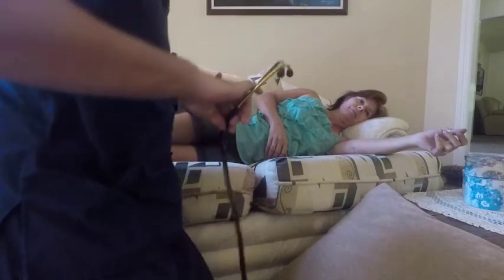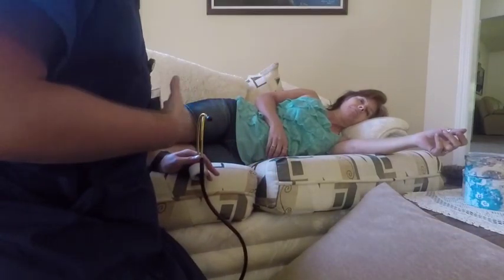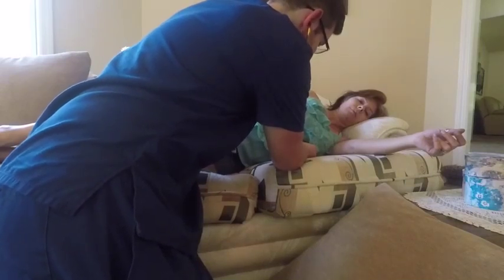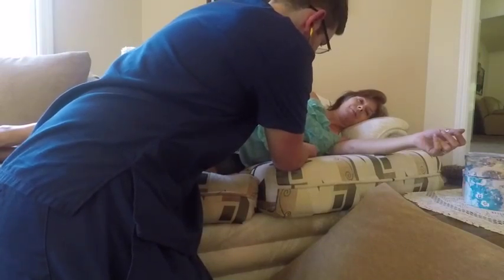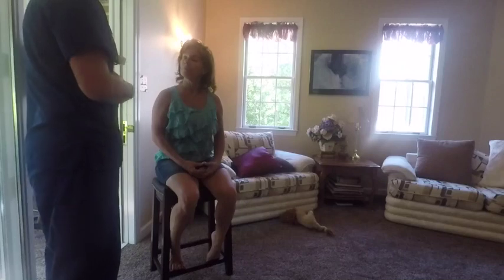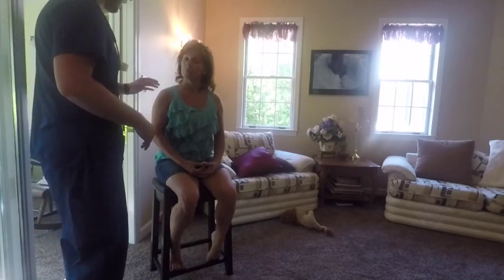This is the optimal position for us to listen to your mitral valve to hear if there's any sort of murmurs. So I'm going to auscultate here the fifth intercostal space, left midclavicular line, with the bell of my stethoscope, and I, again, did not hear any sort of murmur, which is very good.